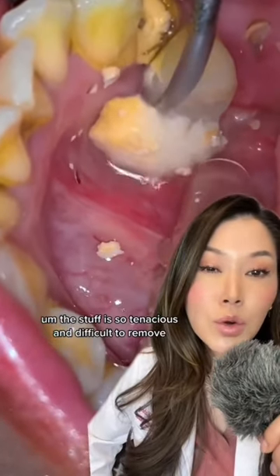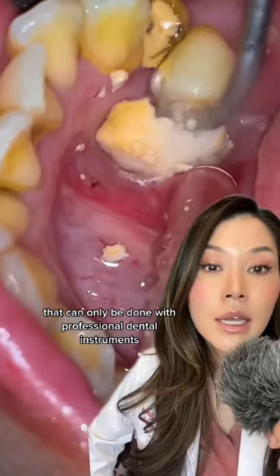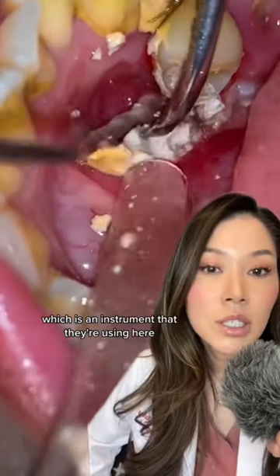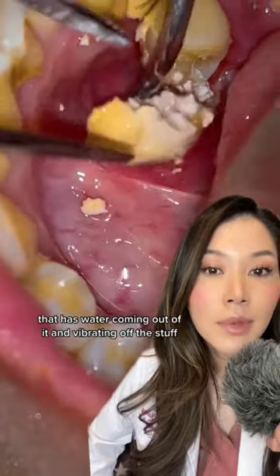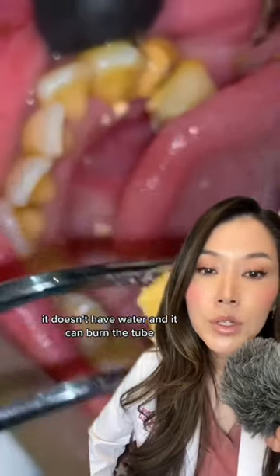This stuff is so tenacious and difficult to remove that it can only be done with professional dental instruments. I know people who have tried to buy the Cavitron — the instrument being used here that vibrates with water to remove this buildup — from Amazon, and I really wouldn't recommend it. It doesn't have water and it can burn the tooth.